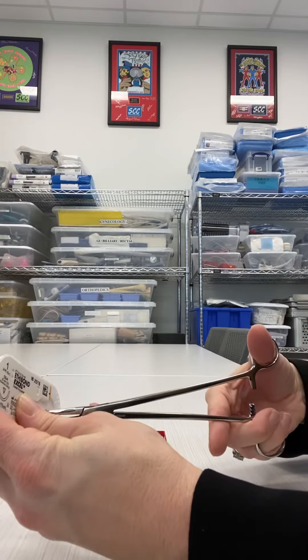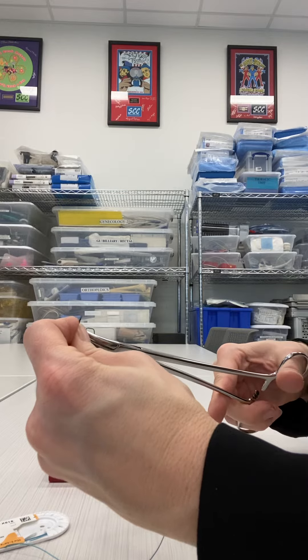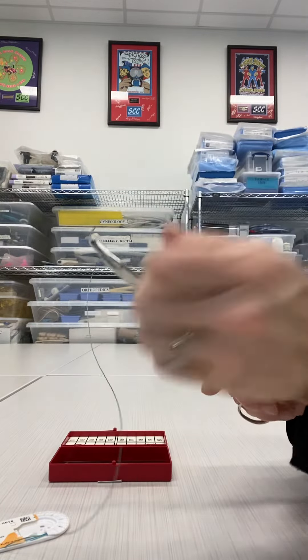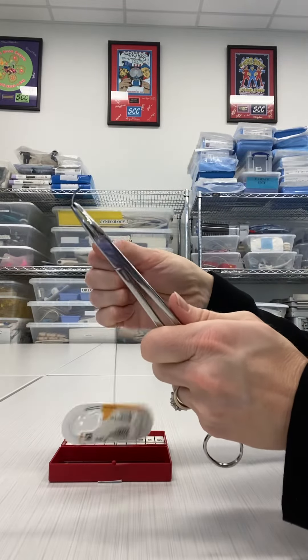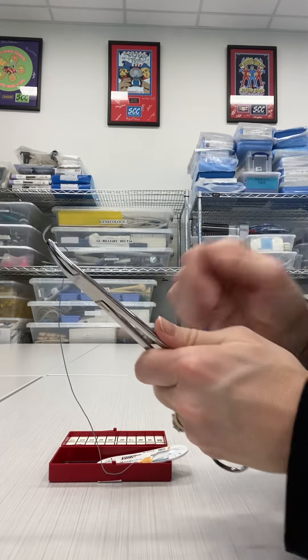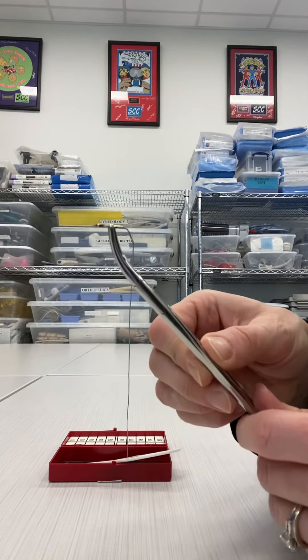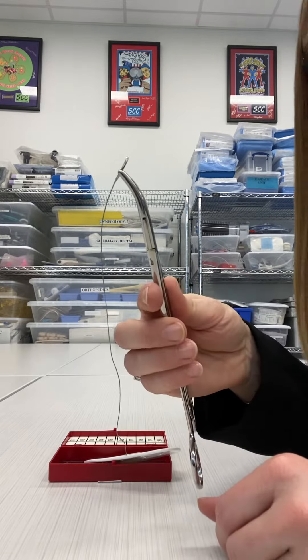I am just going to take that Haney needle holder and come straight onto the needle. The needle itself is still going to have the tip coming to the midline, or to the left in this case, and the suture coming out to the right. I am going to be two-thirds of the way from the tip, or a third of the way from the swedged end, and I want to make sure that I am on that flat section of the needle on the inside there.